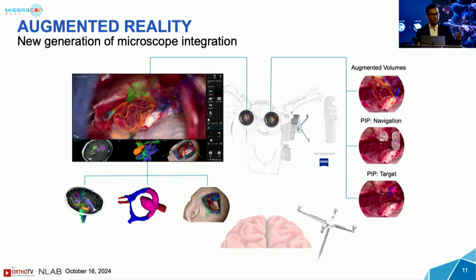So this can be augmented through your microscope. With the advanced microscopes, for example, you can have color coding. You can have your tumor margins delineated. You can look at your vascular flow. You can look at aneurysms. You can look at AVMs in the spinal cord. So many things that the technology will allow you to see real time. So this is how far we are going.